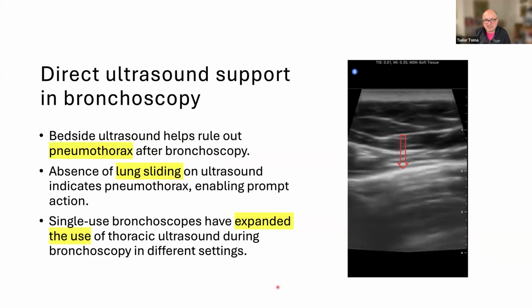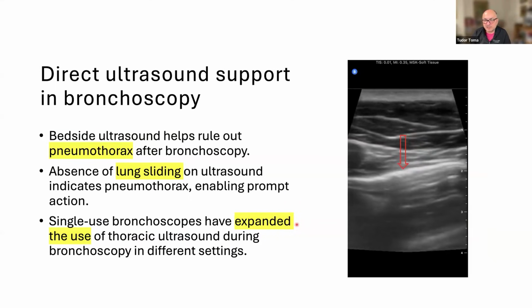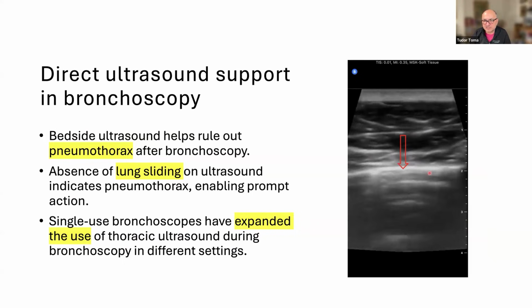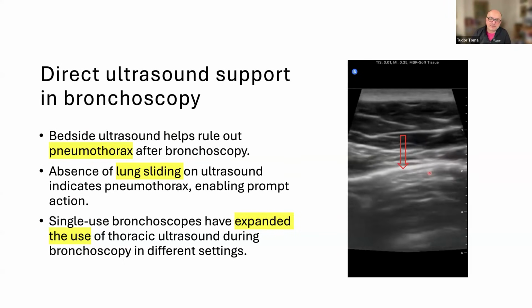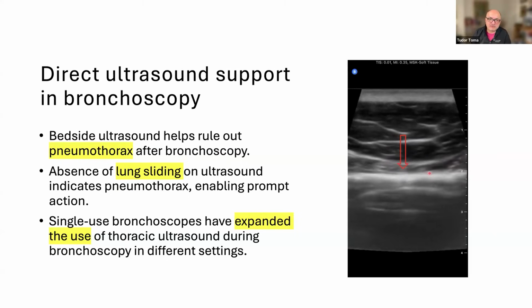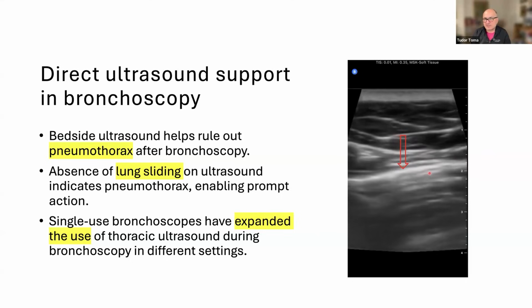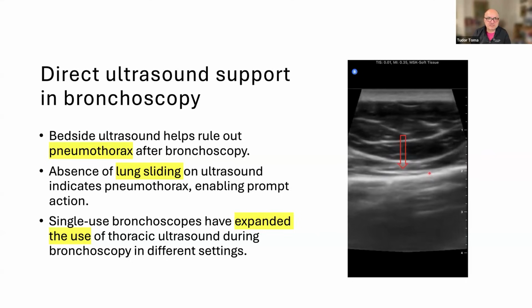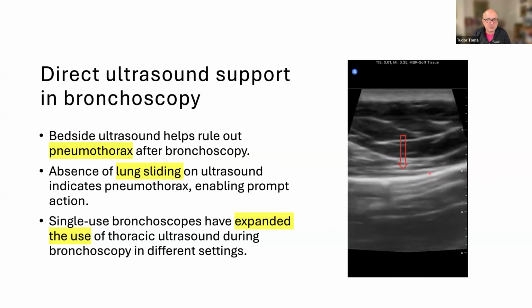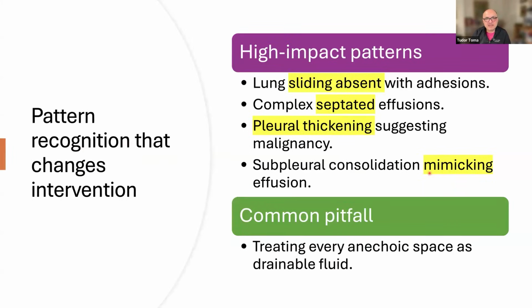This is basically the slide which illustrated my talk from the previous slide, which shows that it's very easy with this pocket ultrasound to demonstrate pleural sliding, and therefore the patient doesn't have a pneumothorax, and we can move on, and it's a safe procedure. So we can be sure that the procedure was not with complications.